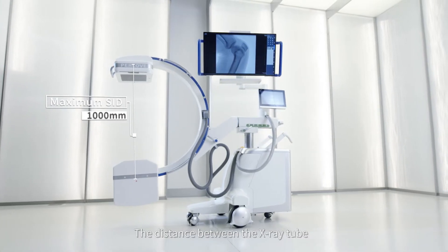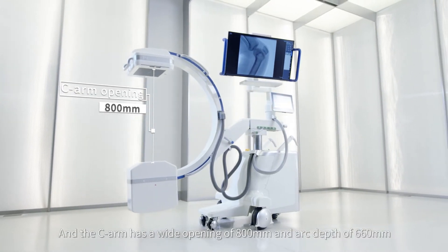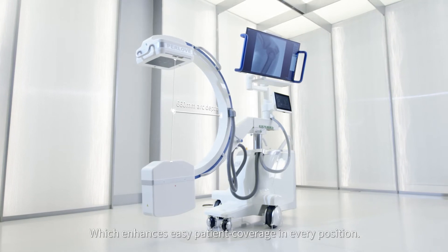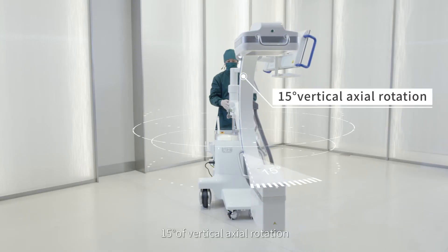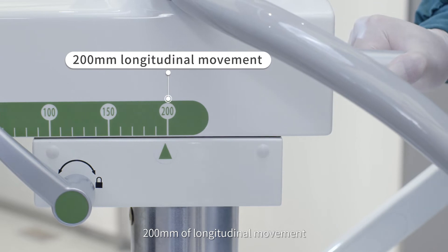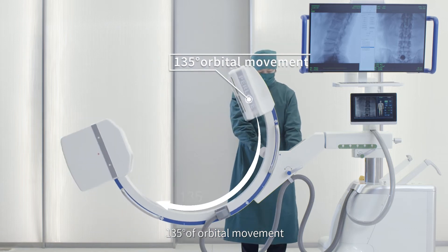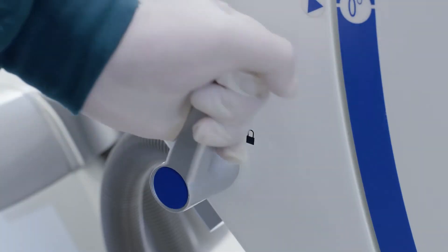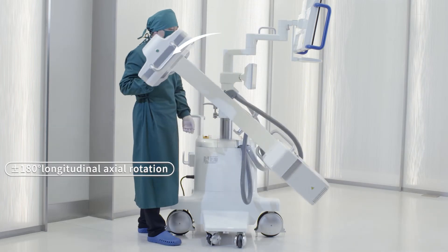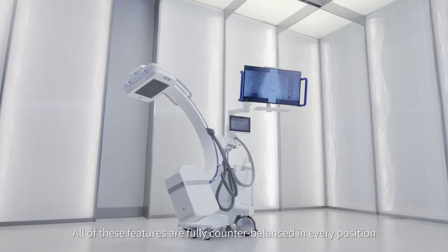The distance between the X-ray tube and the flat panel detector is 1000mm. The C-Arm has a wide opening of 800mm and arc depth of 660mm, which enhances easy patient coverage in every position. Features include 15 degrees of vertical axial rotation, 200mm of longitudinal movement, 135 degrees of orbital movement, and 360 degrees of longitudinal axial rotation — all fully centered and counter-balanced in every position.